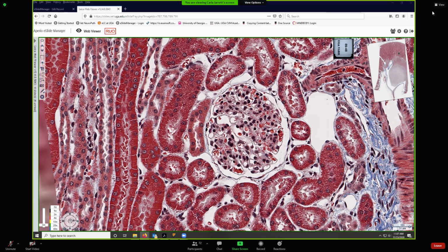Let's see what else. Now we changed, so we were through with the urinary system and we went into the special senses. So there was a question that said select all of the listed components that makes up the membranous labyrinth.